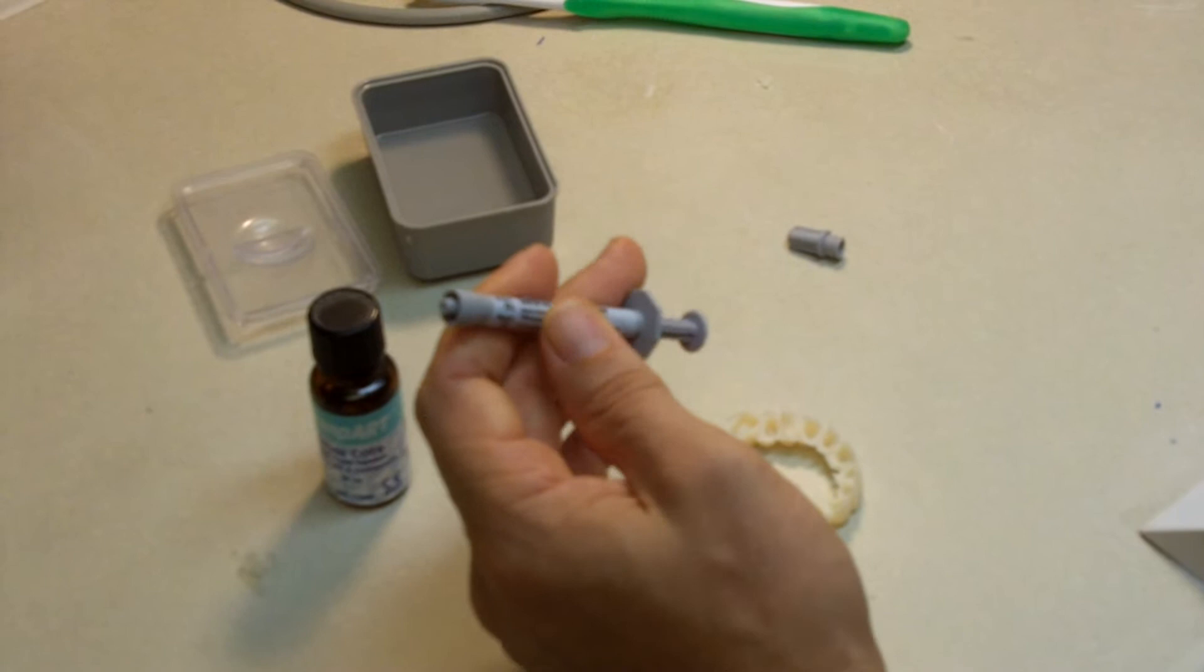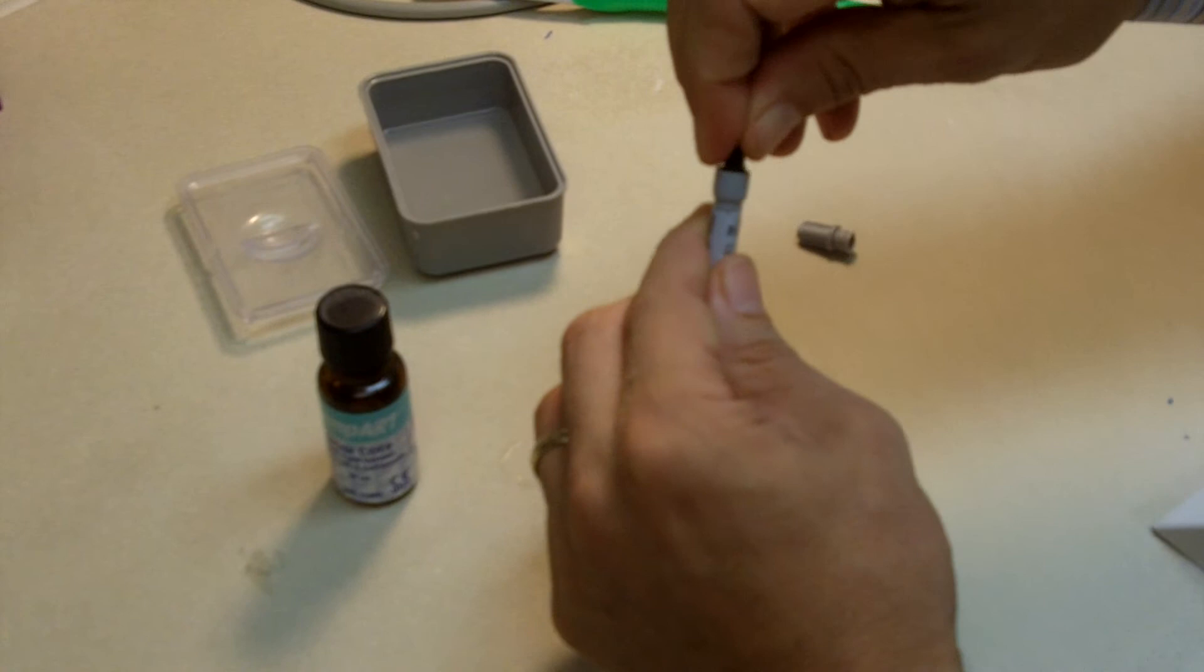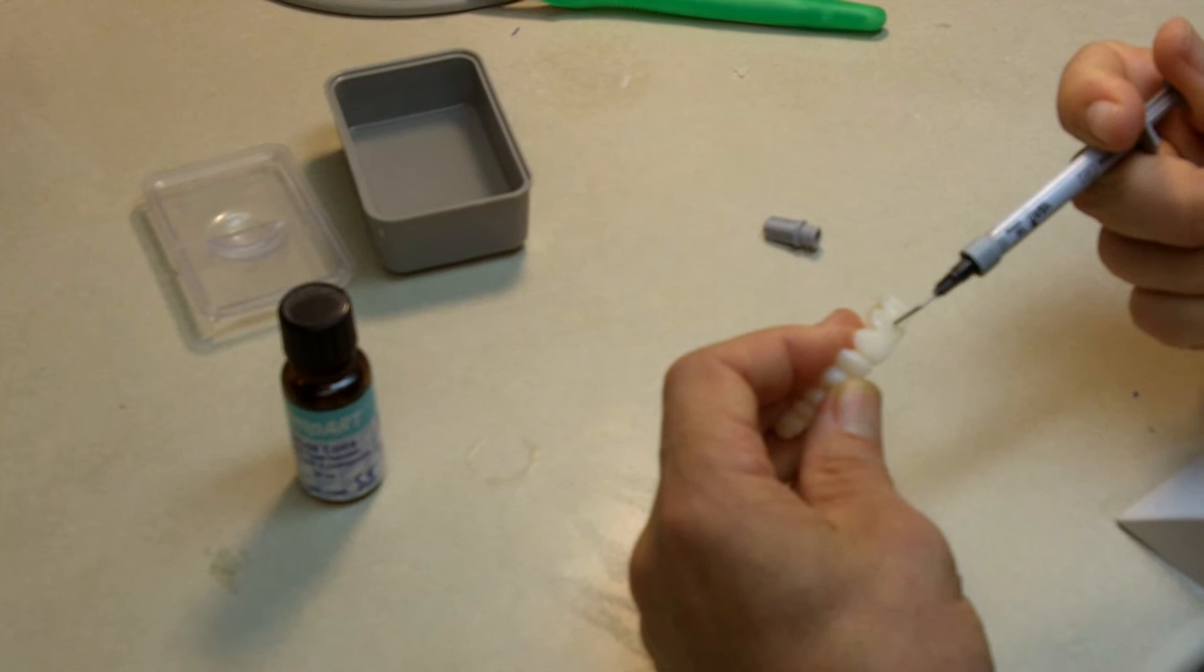And I'm going to add a little syringe here, and I'm going to add directly to the area that I want. And then I'll spread it out and cure it and polish it.